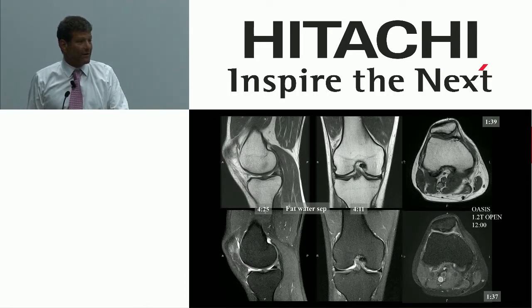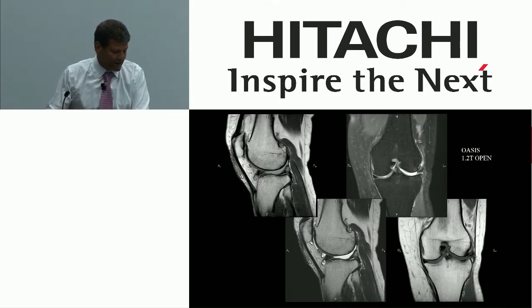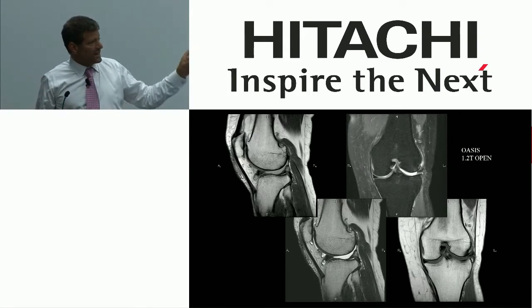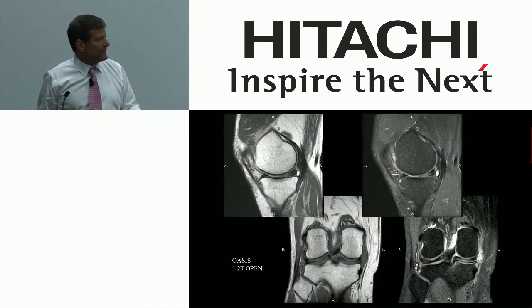It's hard to do that on low field, but you can do it on a high field system. Here's the same thing, PD fat sat. These are both fat sat techniques. One scan for the sagittals, one scan for the coronals. I think it makes an enormous difference.